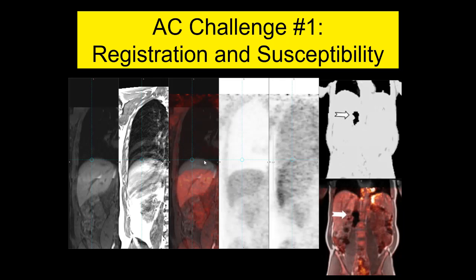Another issue to keep in mind, which is purely for PET MR and not on PET CT, is susceptibility artifact on T1-weighted images, because your Dixon images are gradient echo images. Your surgical clips and other metallic artifacts will give you signal loss, and the signal loss would show up on your pseudo CT images and will show up on your PET MR reconstructions.